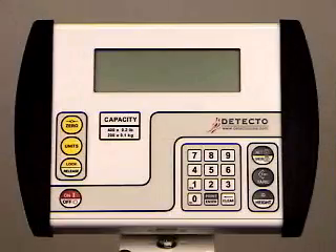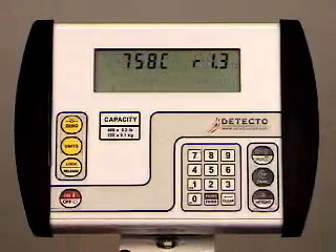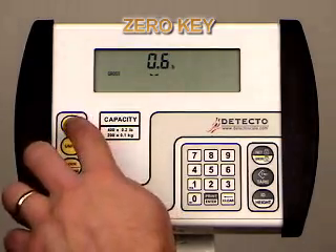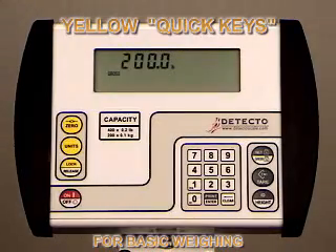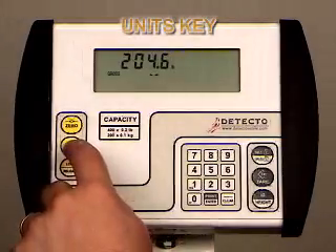To begin, turn the power on, making sure the scale platform is clear. The 758C indicator will go through its opening sequence. It will power up to zero if that function is enabled. If it does not power up to zero, simply push the zero key. For weighing-only use, the yellow quick keys on the left side of the 758C provide fast, easy operation even by first-time users. These keys may be all that you need for basic weighing, and they're highlighted in yellow to find easily.